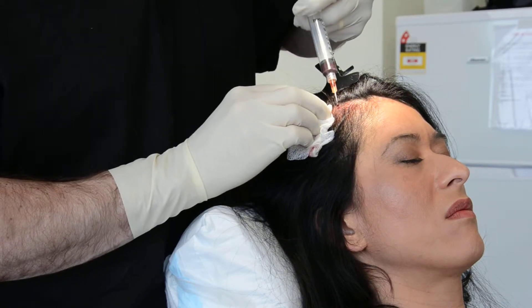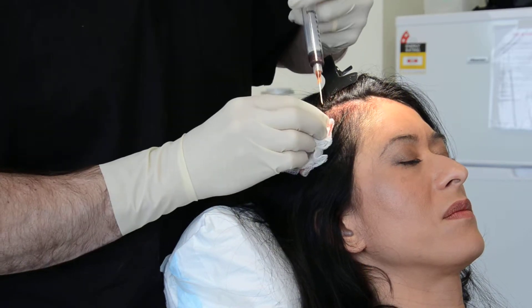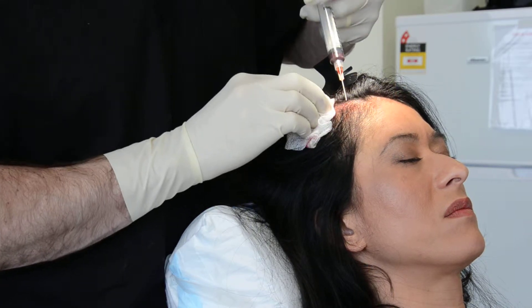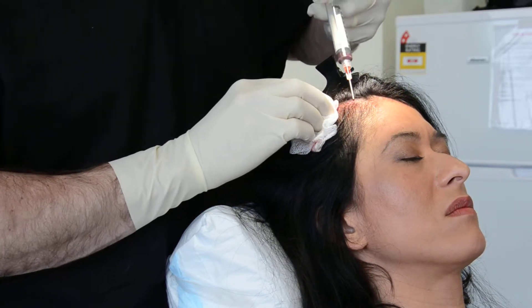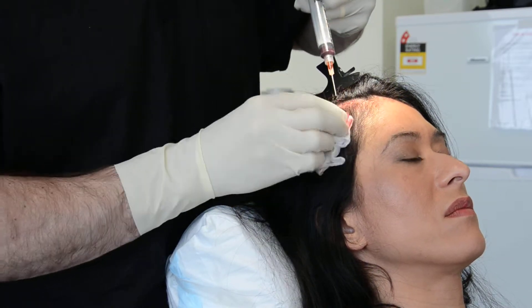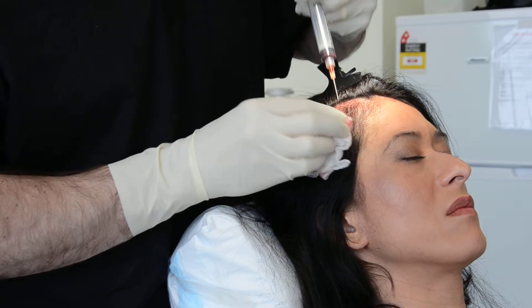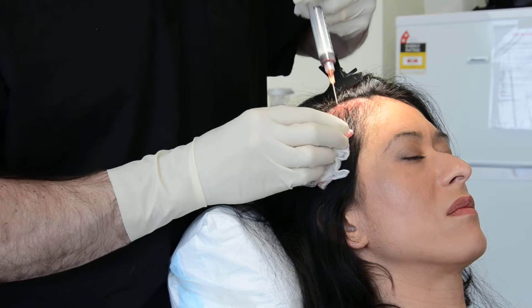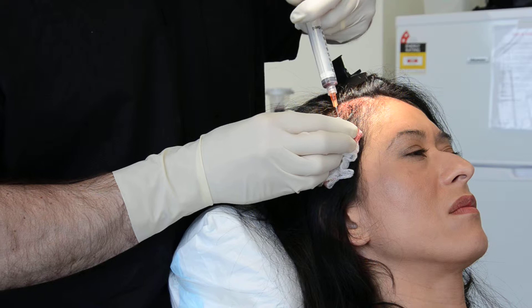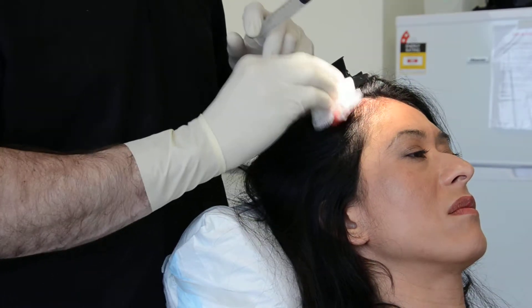We're just about finished infiltrating this whole section with the activated PRP. For the patient, it's a relatively painless procedure with not much more than about one hour of downtime. After the procedure, we instruct the patient to avoid strenuous activity for at least a few hours, and they can't wash their hair until the following morning, but normal social activities can occur.